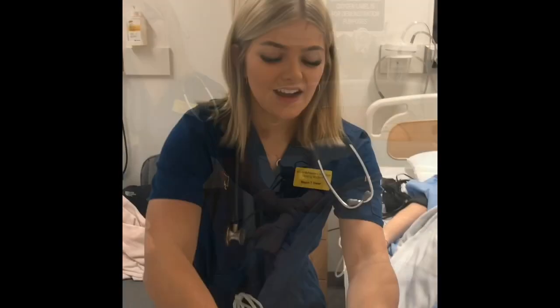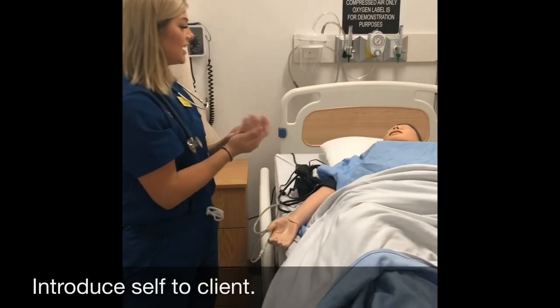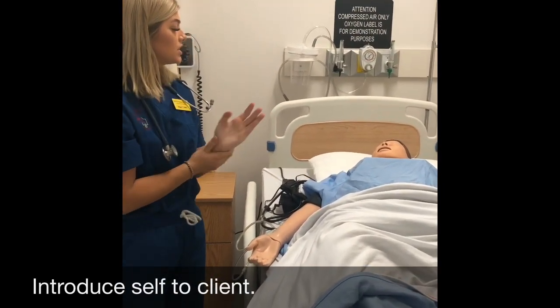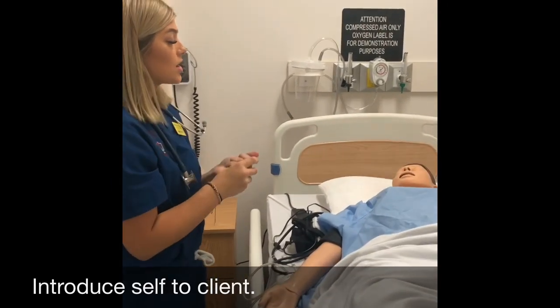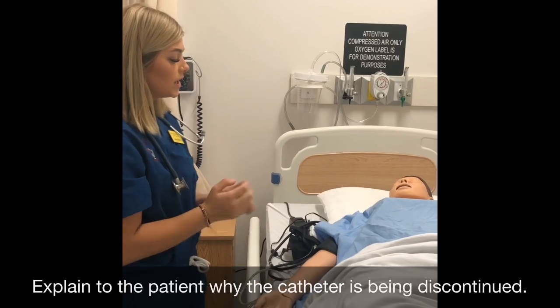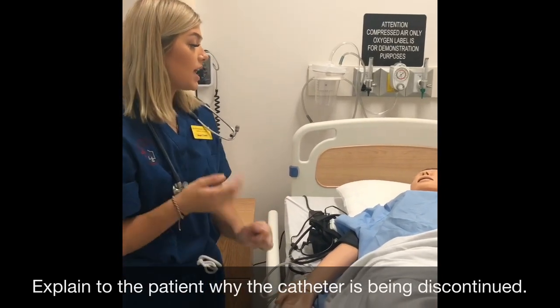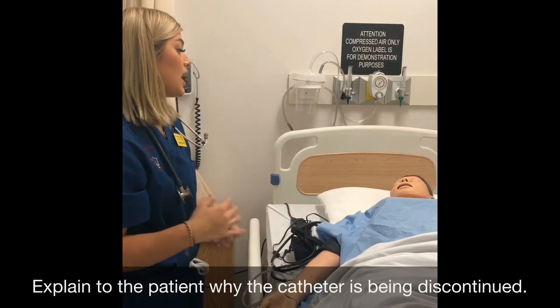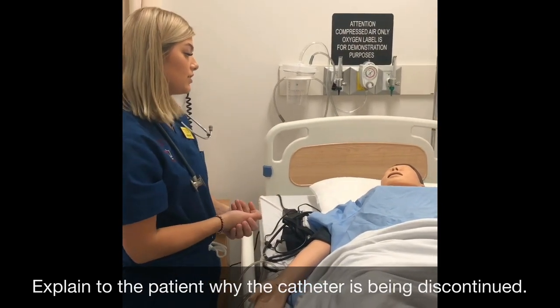Good afternoon, Mr. Mancini. It's me, Megan, again. I am your student nurse, and I have good news for you today. Your surgeon assessed you, and your catheter is going to be discontinued as per the order of the surgeon. It seems that you have been able to ambulate and walk more frequently, and your urine output has been adequate, so your catheter is coming out.